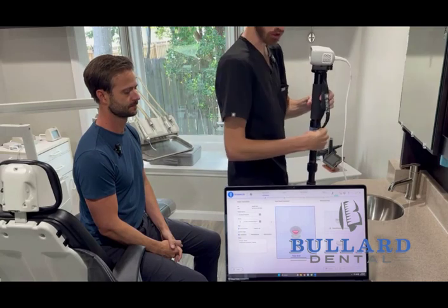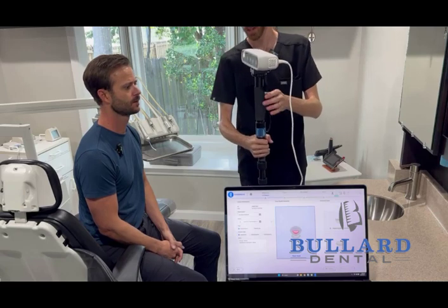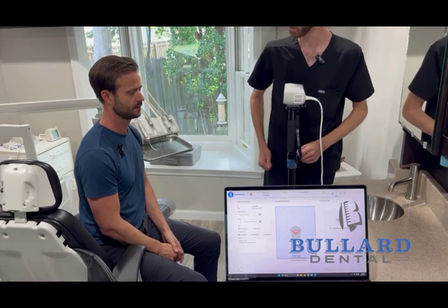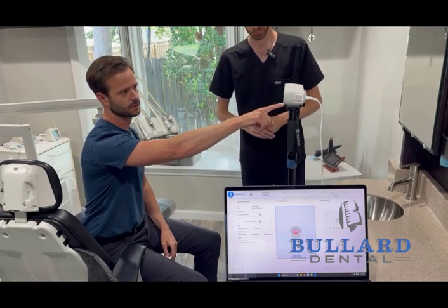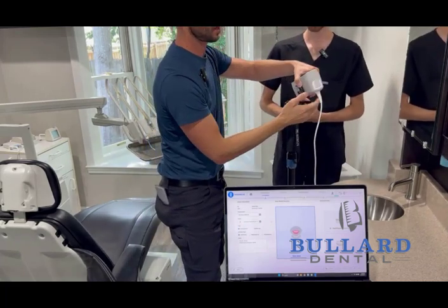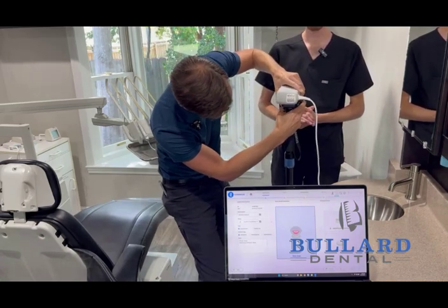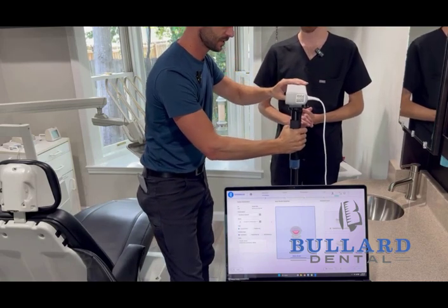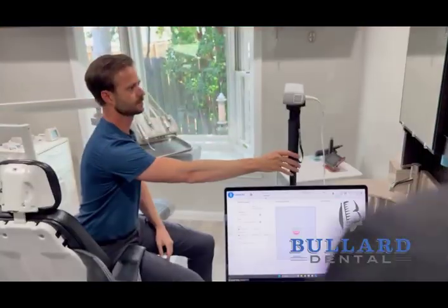One thing we wanted to show you is our mounting system. We use a monopod from SIRUI — you can purchase it online. We use it a lot around the office and it works well for this facial scanner too. You can get it off VNH Photo or Amazon. There's a generic quick-release connector that just pops on to the top. You can quickly remove it and place it back, and we have different adapters for phones and other devices to sit on this monopod.